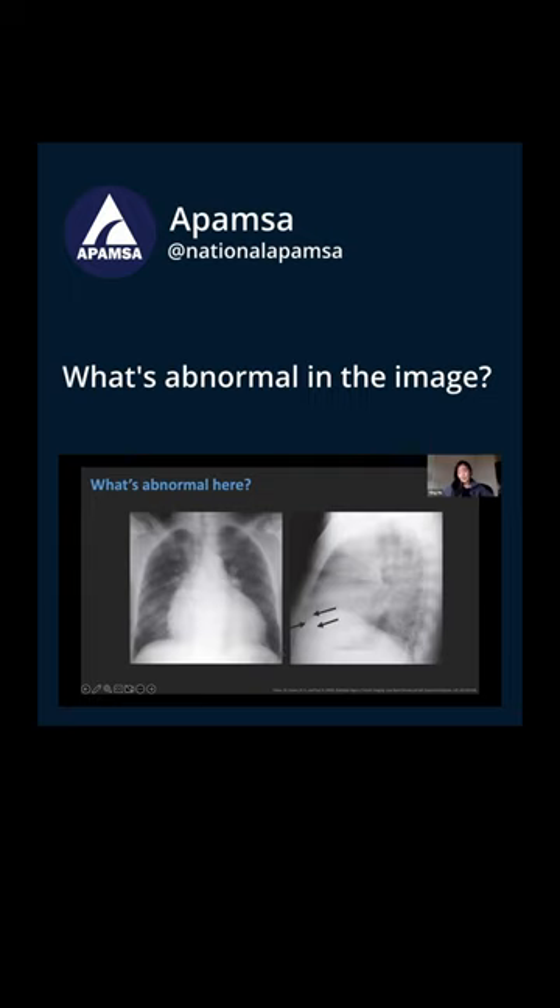And this is a hint here with these arrows on this lateral view — you sort of have the epicardial fat as well as the retrosternal fat forming like a little Oreo cookie sign, and there's some radio-opaque stuff in between.